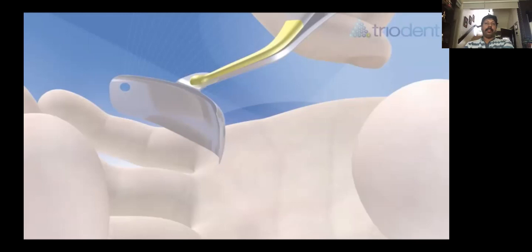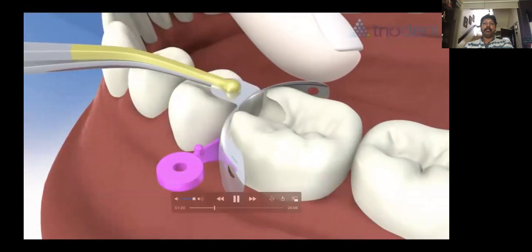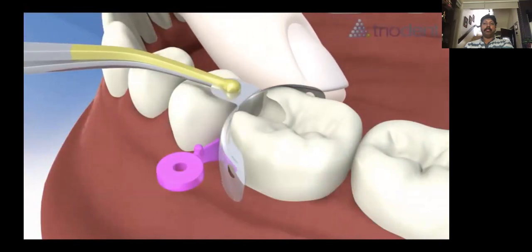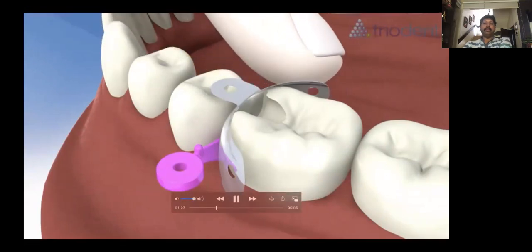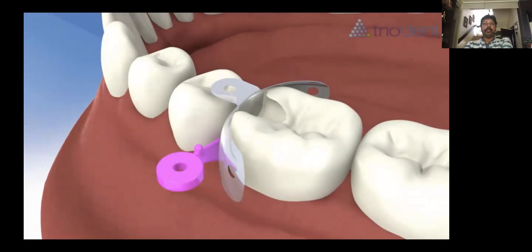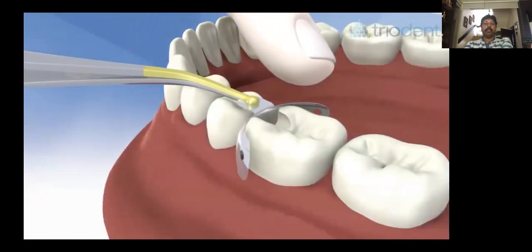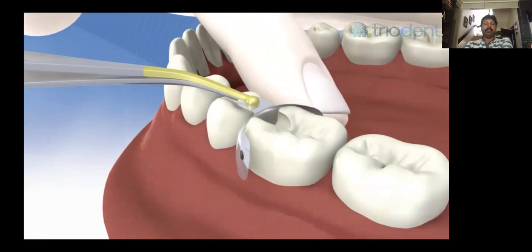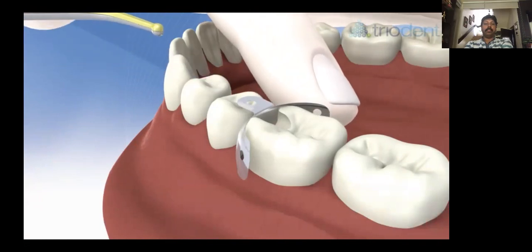Have the gold side of the tweezer tips, the side with the pin, facing away from the tooth. This way, the pin will not hook the tab when you release the tweezers. Slide the matrix between the wedge and the cavity. Alternatively, cut the prep first, then place the matrix, followed by the wedge. Trap the matrix with a finger on the lingual side to keep it steady when you release the pin tweezers.